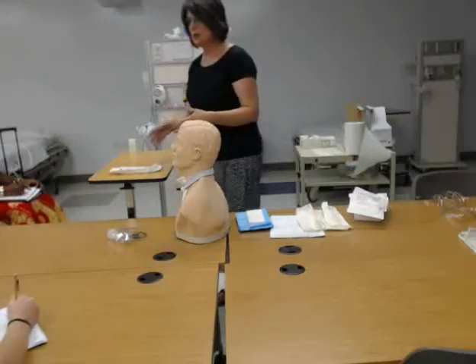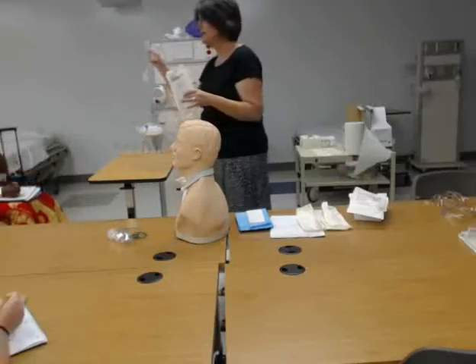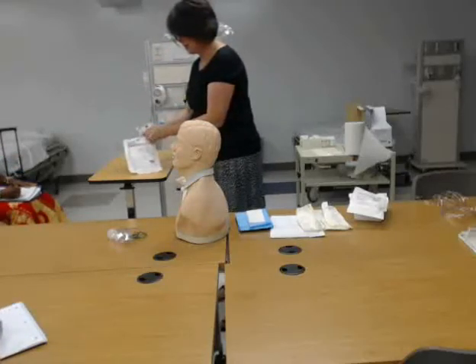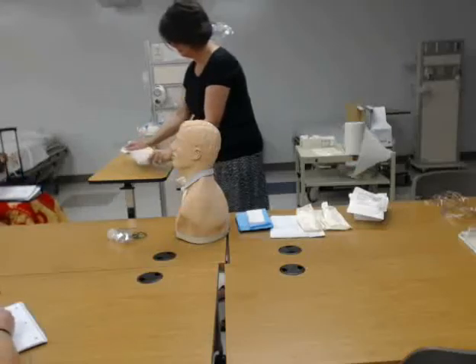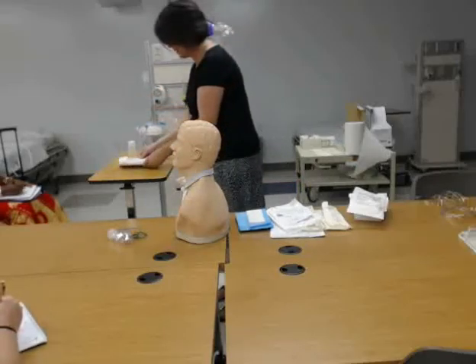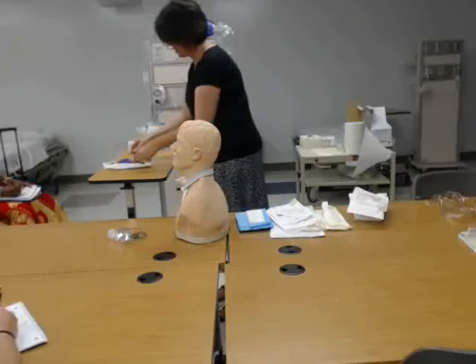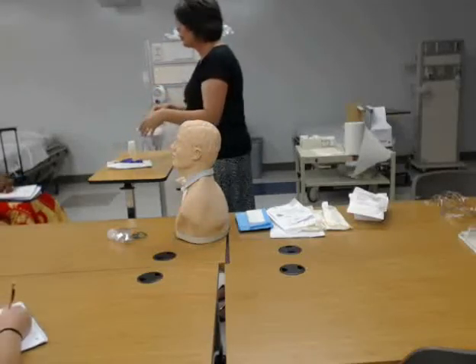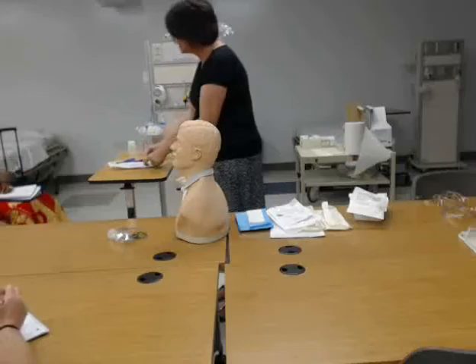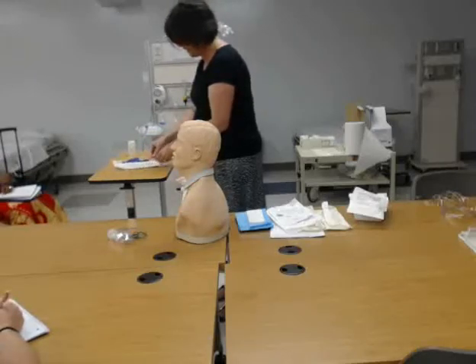The equipment we need when we actually go to suction is a sterile suction catheter kit, working suction, and sterile saline in a bottle. What we want to do to start is open up our package. Inside is an inner package that is also sterile. Some packages have the little container tucked right in, but this one is actually inside. The technique is going to be the same, but where you find the little container might be slightly different.